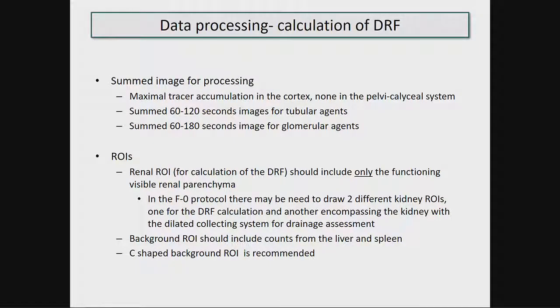This actually means that if you are using the F0 protocol, there may be a need to draw two different kidney regions of interest, one for the differential renal function calculation and another encompassing the kidney with the dilated collecting system for proper assessment of drainage.